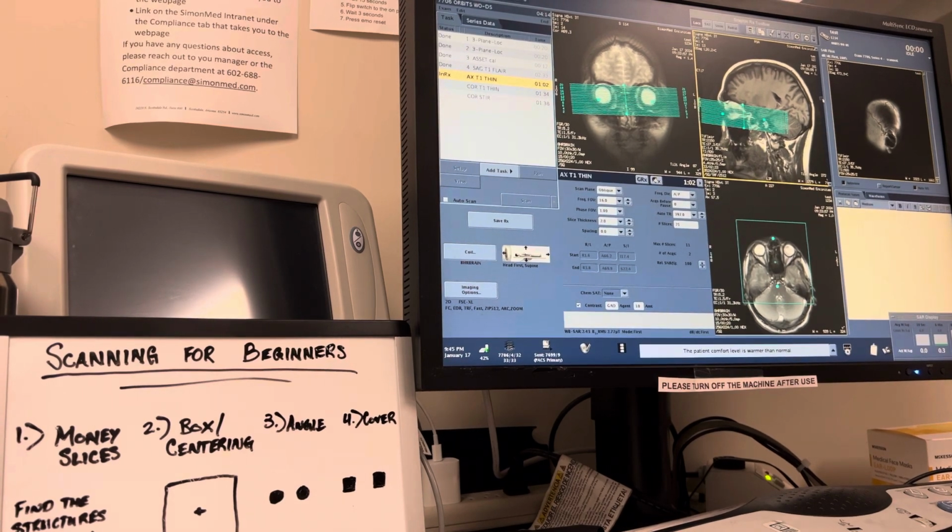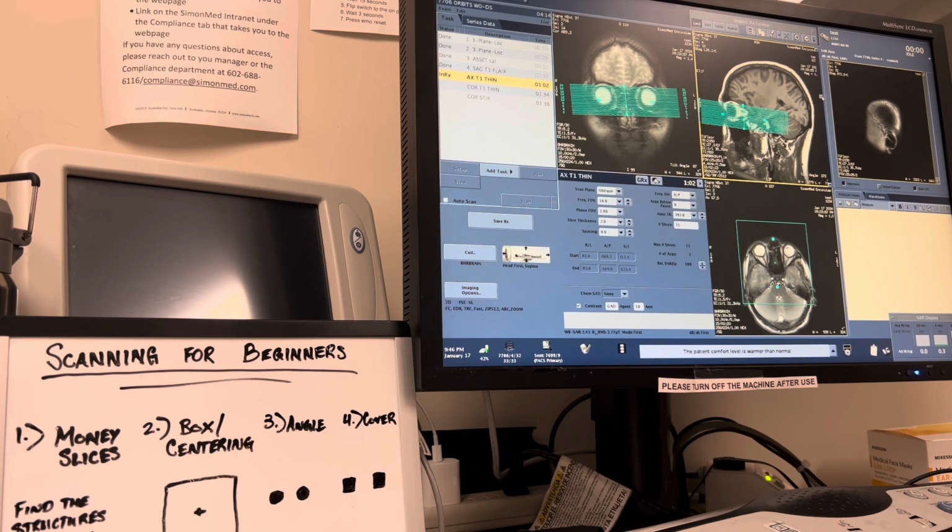Okay, we're going to use those top two, the one above it and the one above that. I want you to scroll back and forth between this image and the next one above it, and angle the slices with that. Keep in mind, you have to use both of those images to tell me which way the optic nerve courses, and then you angle with it. So we're going to use the circles. I'd go a little less than that. A little less than that.